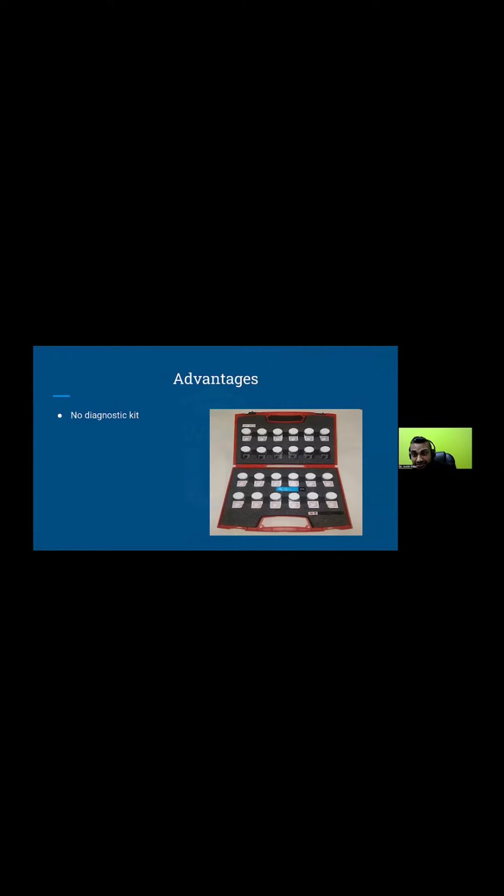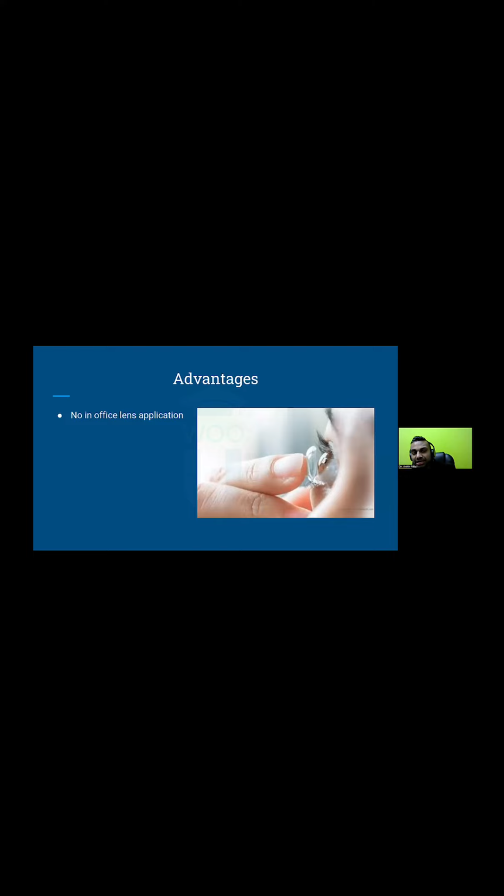So with these custom designs, some of the advantages: you don't need a diagnostic set. You're not pulling out a set from years ago, putting a lens on the eye and trying to manipulate it. It's all software integration. So there's no need to put a corneal mold on a patient's eye, evaluate it, take measurements, and then design off of that. That can sometimes be a tricky situation, especially with young kids. Now, there are some advantages to putting a design on the eye, so you can get the initial reaction, but it just goes so much smoother if you can just get the initial data and then design it, and then have a really joyous occasion when the patient comes in later on, when the molds come in, and you can say, hey, we're ready. This is when we start the process. And the initial evaluation isn't a big hand-holding session.